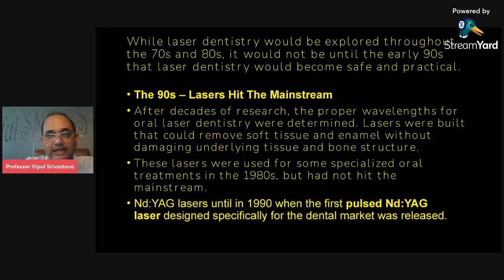What is a soft tissue laser and what is a hard tissue laser? Before that, you just need to see some more interesting slides I have got. So this was a soft tissue laser.